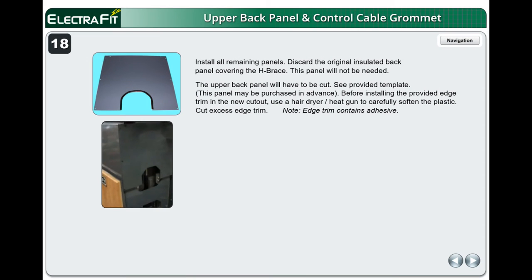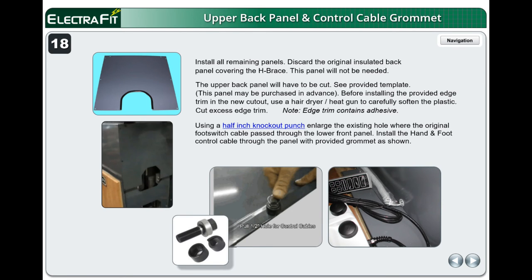Install all remaining panels. Discard the original insulated back panel covering the H-Brace — this panel will not be needed. The upper back panel will have to be cut; see the provided template. This panel may be purchased in advance. Before installing the provided edge trim in the new cutout, use a hairdryer or heat gun to carefully soften the plastic. Cut excess edge trim. Note: edge trim contains adhesive. Using a half-inch knockout punch, enlarge the existing hole where the original foot switch cable passed through the lower front panel. Install the hand and foot control cable through the panel with the provided grommet as shown. The grommet is installed from the inside of the metal panel.